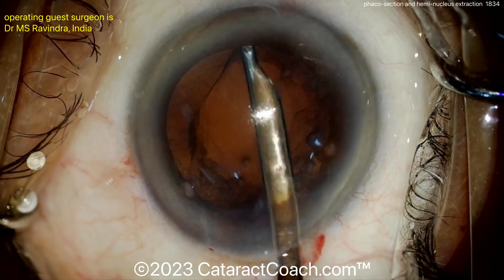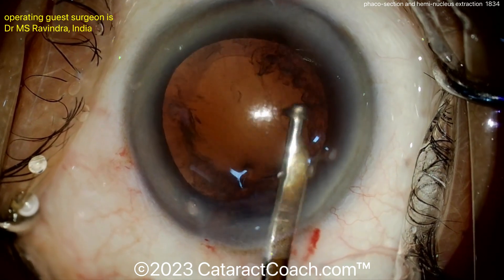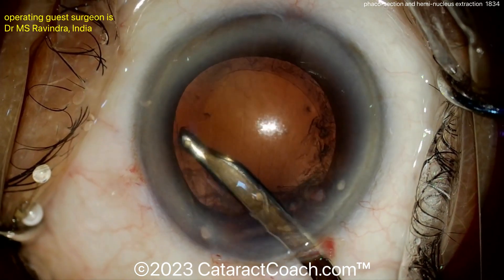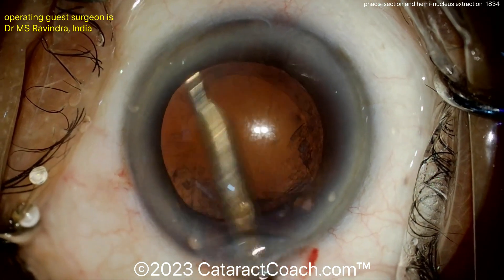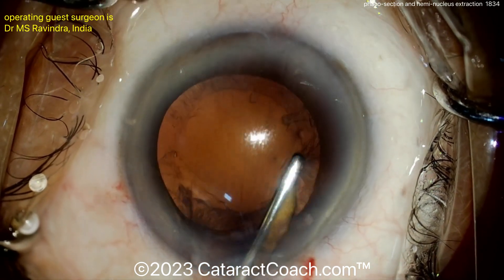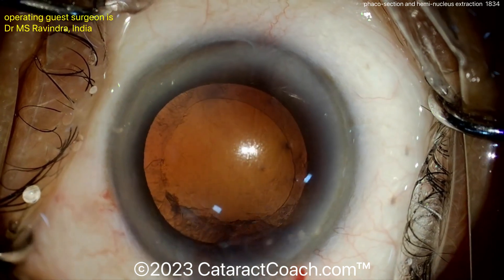Whatever's remaining, the bag can be cleaned up pretty nicely. Just keep in mind you have that large incision here, and using the Simcoe through that large incision you can have a little bit of chamber instability — so caution is of the order. Using that caution and the Simcoe, cleaning up the capsular bag pretty nicely, going around all meridians. The lens can of course be put inside the capsular bag now.